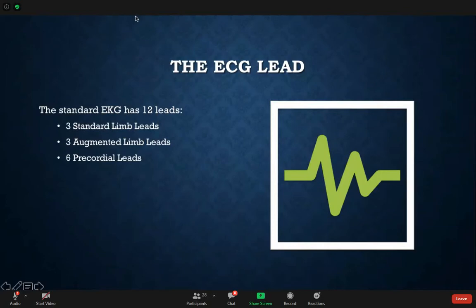Do you know how the ECG happens? Do you know where you attach and how it happens? So yalla, I want you to talk, guys. Do you know how to do the ECG? How to attach stuff, the electrodes? Yusuf, take the mic and tell me how.